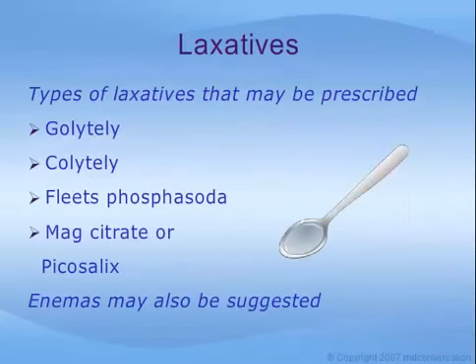You will then be asked to take a laxative. This will cause mild cramping, repeated urges to pass stools, and diarrhea. In an optimal situation, the fluid which is left should be clear or light yellow in color.